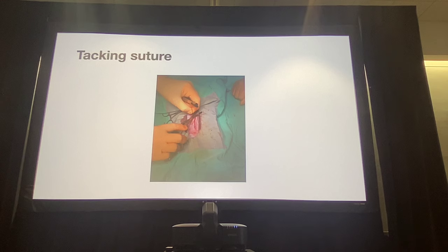The thing is, if you're going to do a knot and then do something, or you have it and then end it, that works. But having a knot is a balance, because the whole idea of having a knot is that there are open edges. So if you have a knot next to it, you just cut both strings.